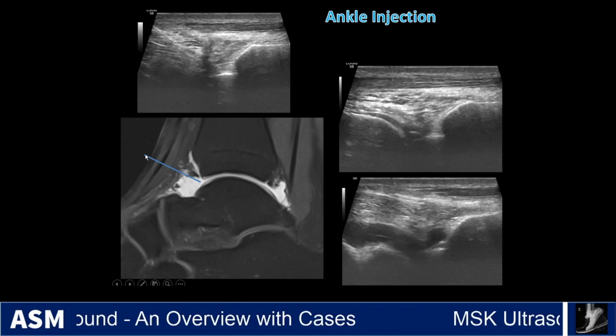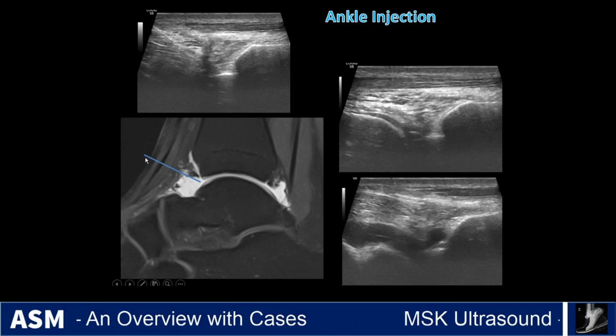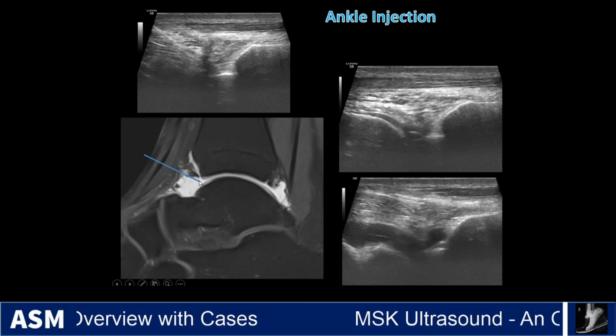What about the ankle? Well, you can do it from a number of approaches. This is the anterior approach. This is for an arthrogram.